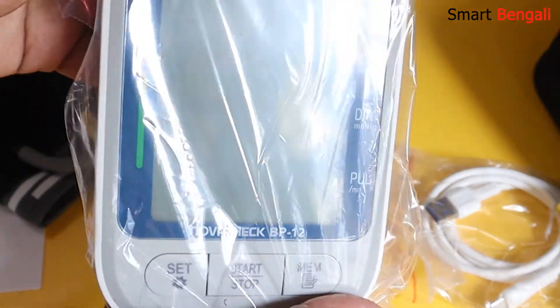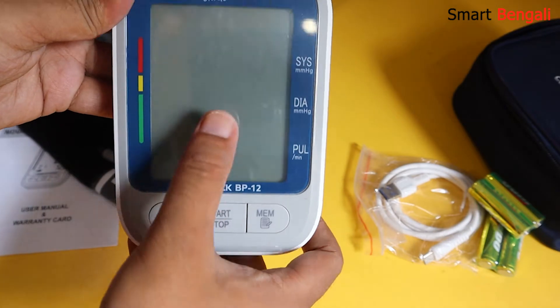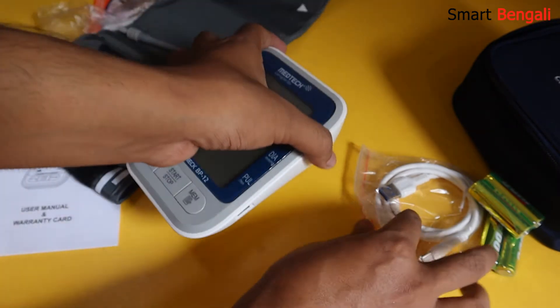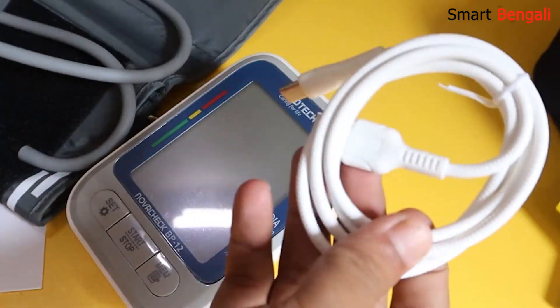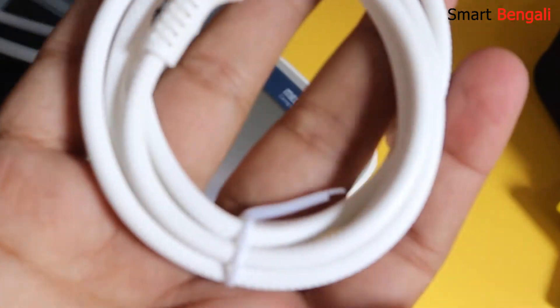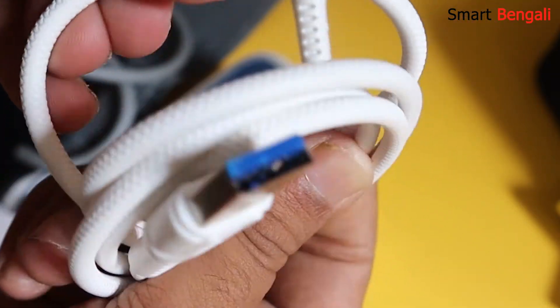And finally here we have the BP machine — tactile buttons, premium build quality, and we have a Type-C USB port here. Let's check the cable quality. This is a really good quality USB cable — I don't think this will break anytime soon. Honestly, I didn't expect this — very premium quality.